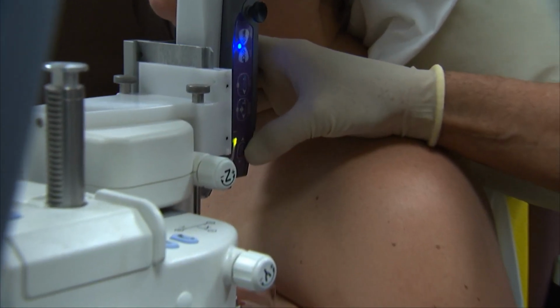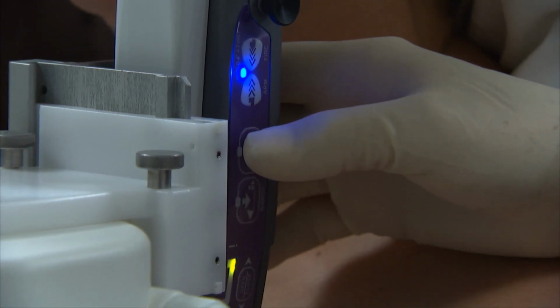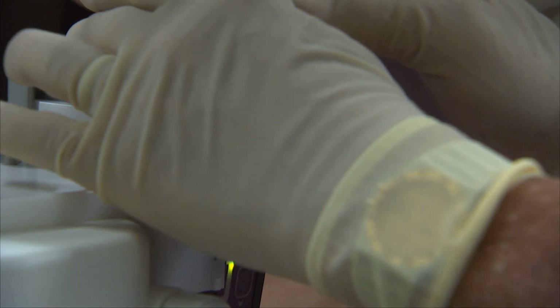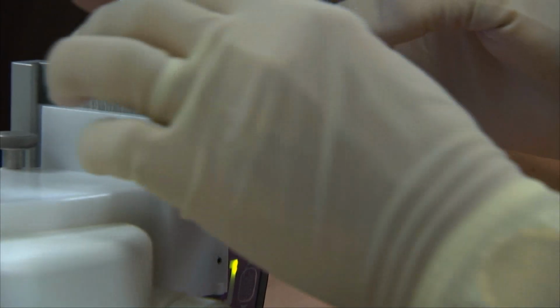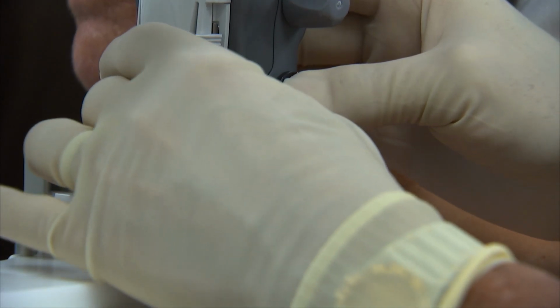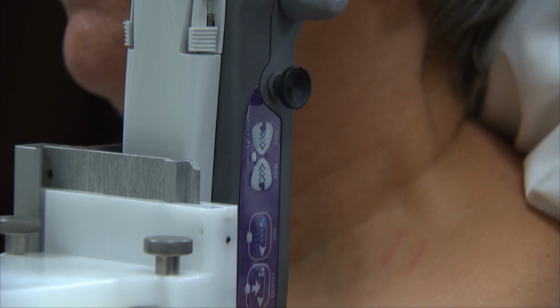Yeah, so I'm going to activate this side. Okay, so it's activated with the blue light. And now I'm going to deploy the biopsy device. So I'm going to tell our patient it's very important not to move. She may feel a little bit of pressure. Okay, so this is the safety, and this is what deploys the biopsy device. Okay, so I put the safety on, not to move, not to move. And there we go. Now we're going to take 2 more post-deploy images.